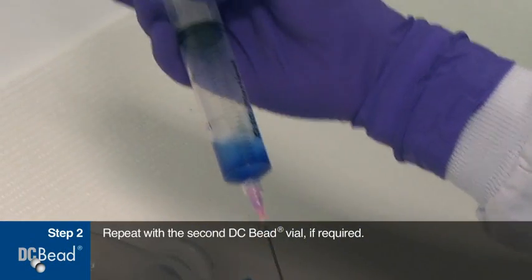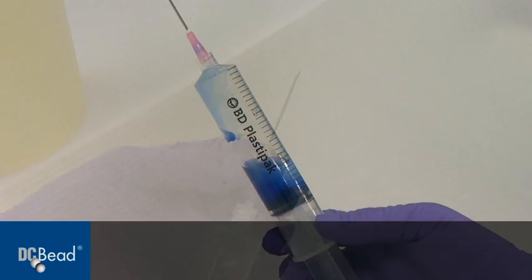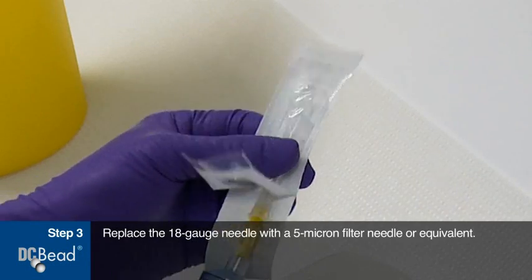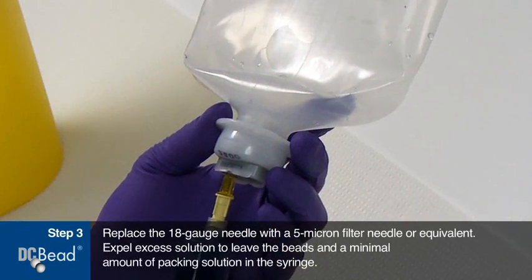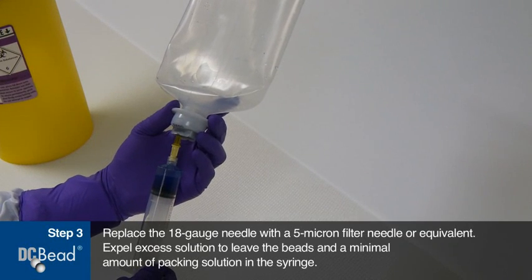Repeat with the second DC bead vial if required. Replace the 18 gauge needle with a 5 micron filter needle or equivalent. Expel excess solution to leave the beads and a minimal amount of packing solution in the syringe.